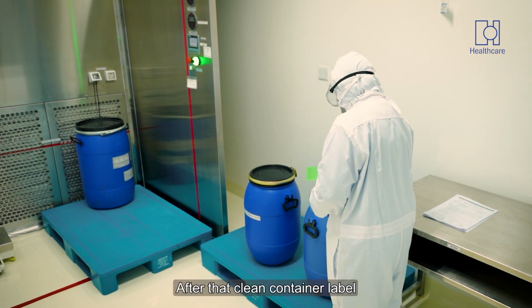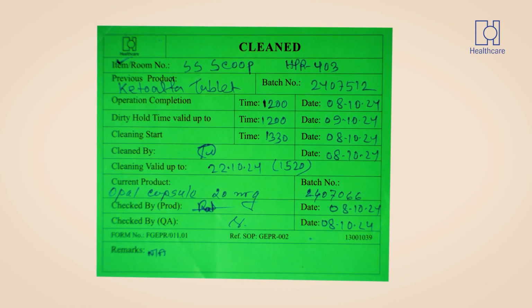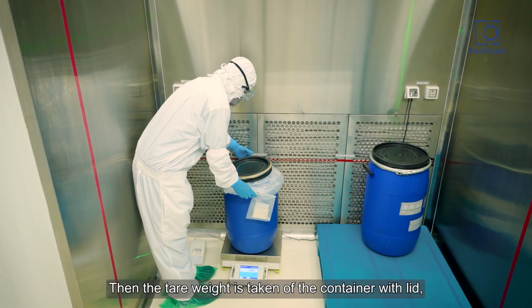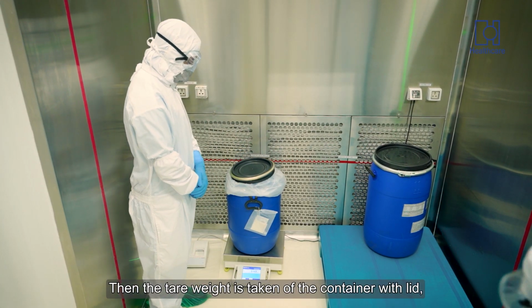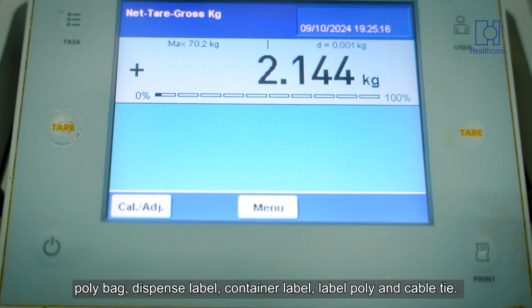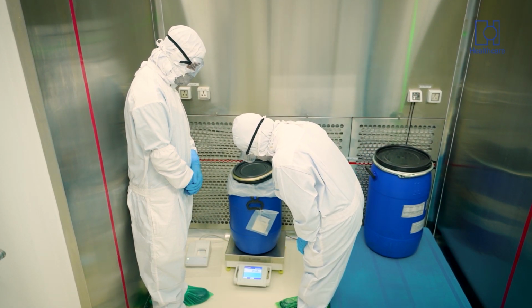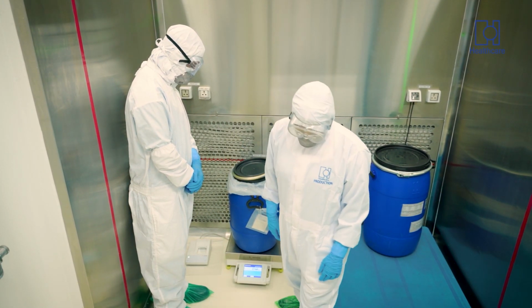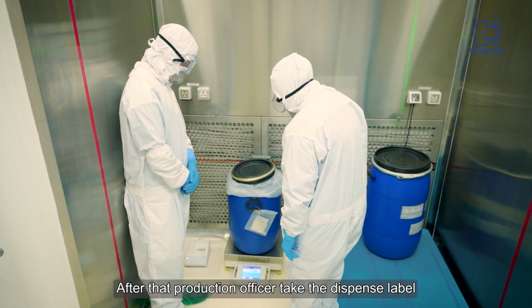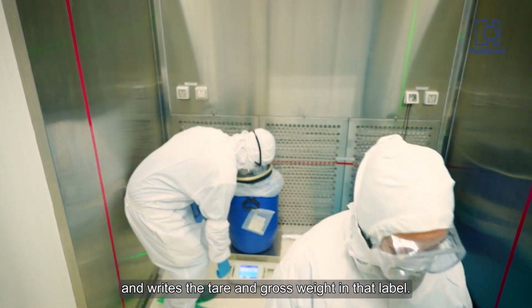After that, the clean container label is also checked by the production officer. Then the tare weight is taken of the container with lid, polybag, dispense label, container label, label poly, and cable tie. The tare weight is checked by the production officer and IPQA officer. After that, the production officer takes the dispensed label and writes the tare and gross weight on that label.